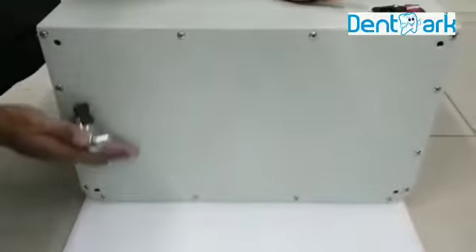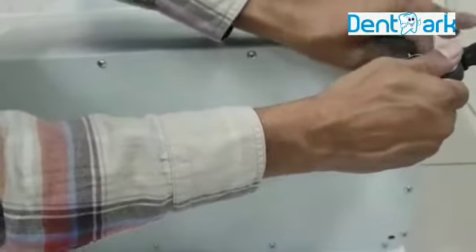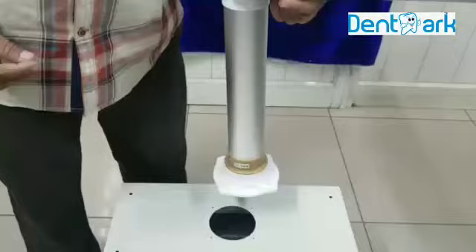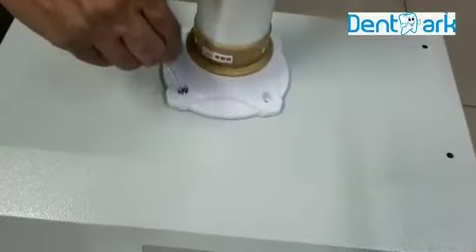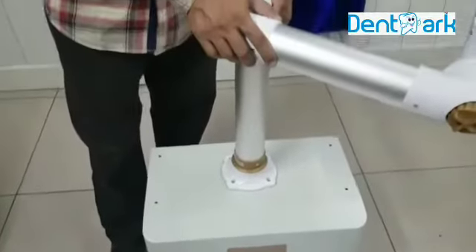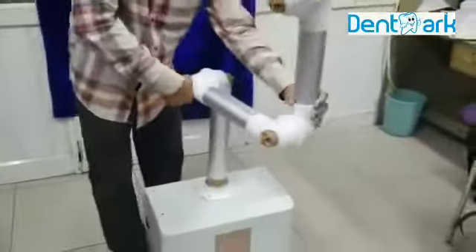This is the bottom side of the machine. It is very easy to fix the wheels. Now fix this arm. It is now fixed. This is 360 degree rotation. You can adjust the arm also.